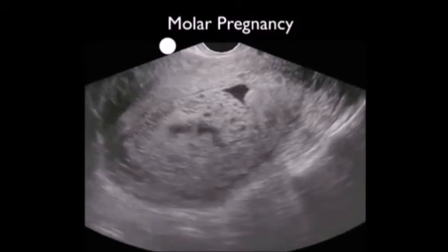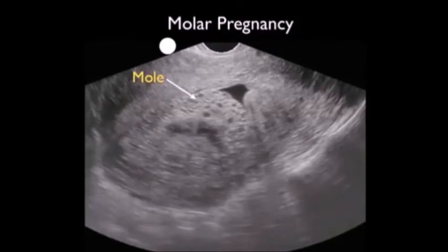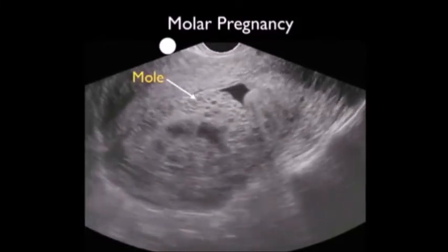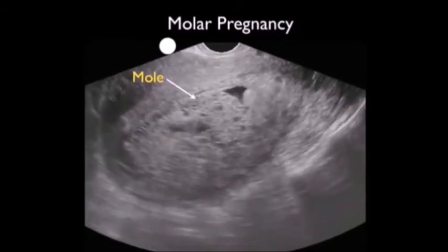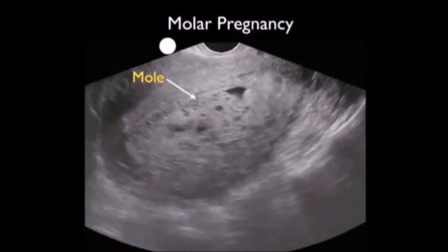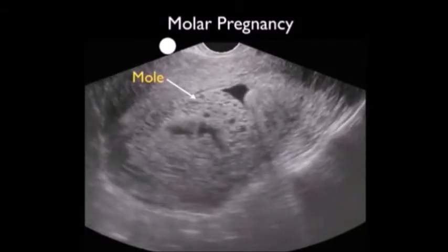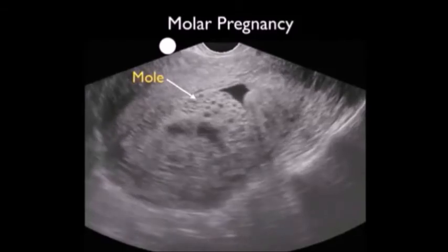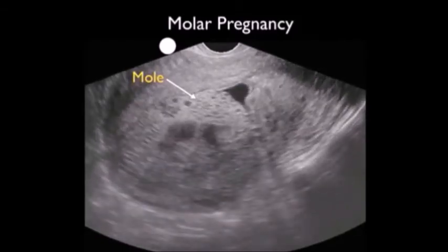Here's video from a patient who presented with a molar pregnancy. Her presenting symptoms were uncontrolled hypertension during the pregnancy, as well as vaginal bleeding and pain. What we see here is the presence of a molar pregnancy within the fundal region of the uterus — notice it has a cyst-like appearance, very different from the normal appearance of an intrauterine pregnancy. As we scan back and forth, it almost looks like a bunch of grapes within the fundus of the uterus. A diagnosis of molar pregnancy was made, and my next move was to get an OB-GYN consultation stat.